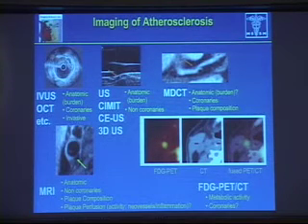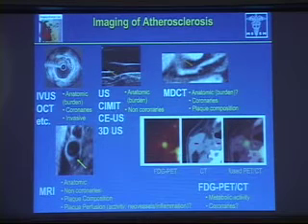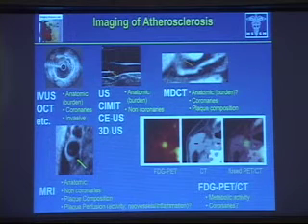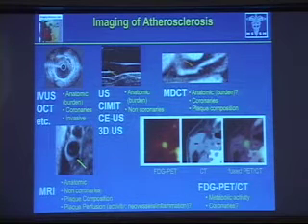And finally, the only technique we currently have really to do molecular imaging, a technique that is commonly used in oncology, and I have to say they have led the way in oncology in terms of the adoption of imaging, is fluorodeoxyglucose. And I will show you a recent paper, actually very exciting, in AAA disease in human. I think this is a direction we're taking.